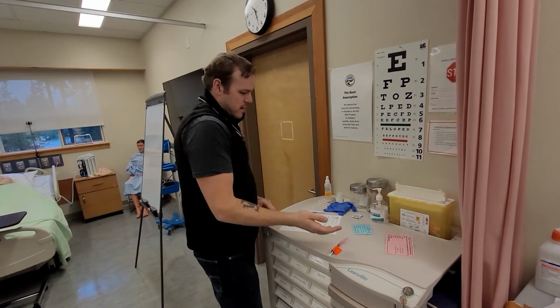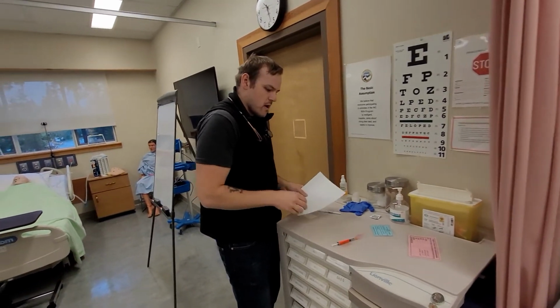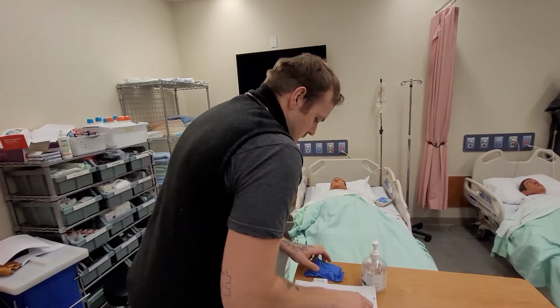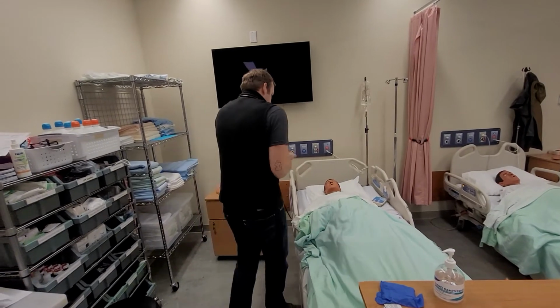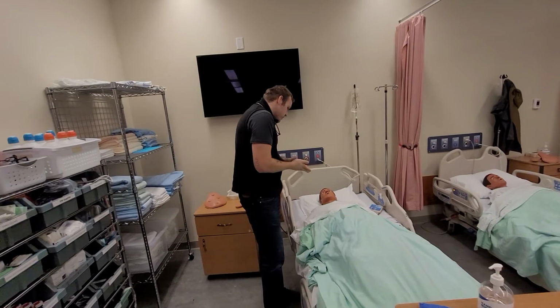Okay, we've got our medication. We've completed our 3 checks. We're good to take our MAR and medication to the bedside. So we're going to introduce ourselves. Hello, Mr. Wilson. My name's Ben. I'm a nursing student. I'm going to be giving you a subcutaneous injection here, and it's morphine for your pain.